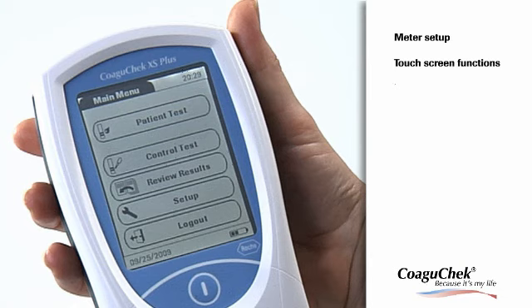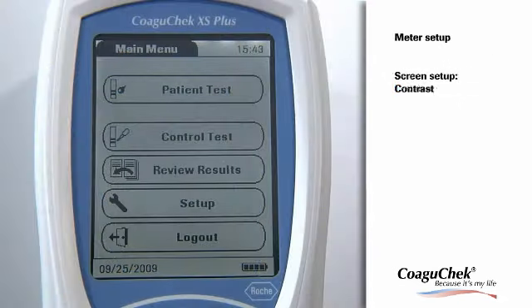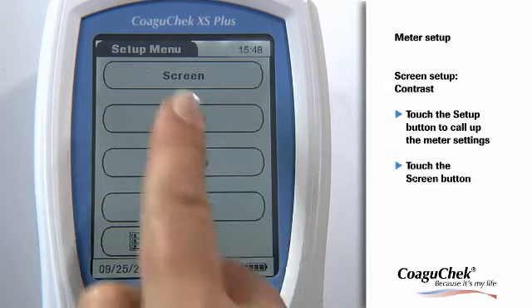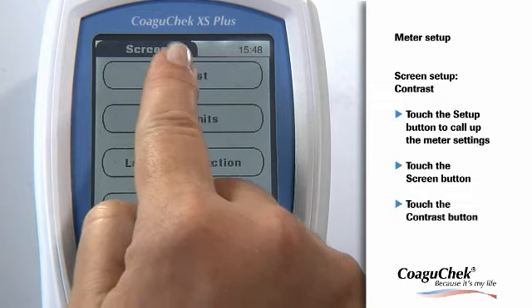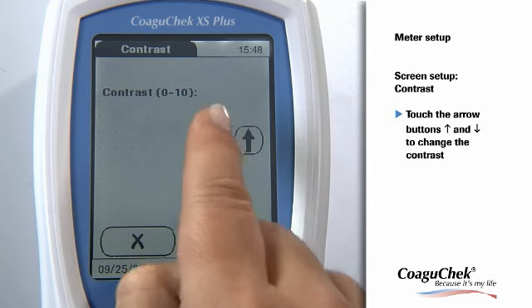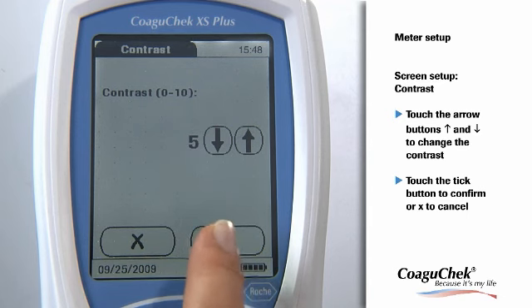The Coagichek XS Plus Meter operates with a touch screen menu. You can call up any displayed function by touching the screen with your finger. To enter and change your screen settings, touch the Setup button to call up the meter settings. If you touch the Screen button, you can find four setup options. First, you can change the contrast. Touch the arrow buttons to change the contrast in a range from 0 to 10, and confirm your setting by touching the Tick button.